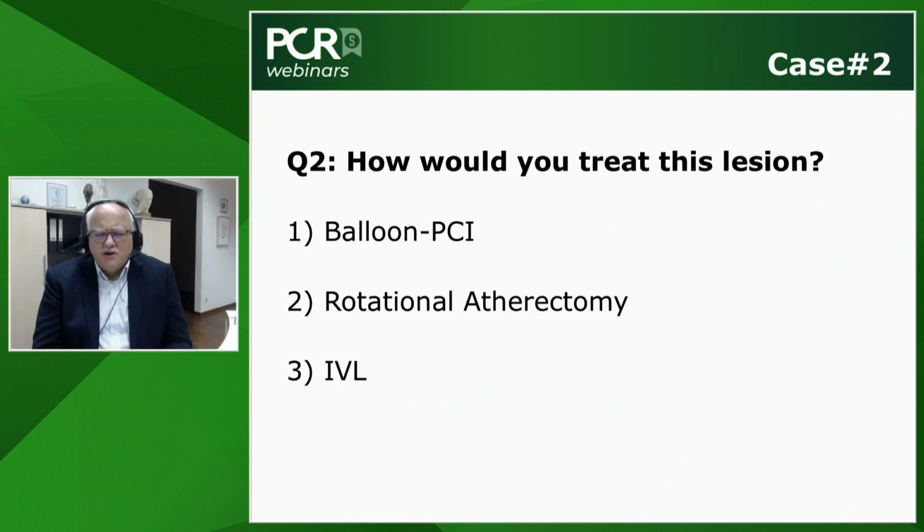So, Emanuele, Benjamin, this is a dominant right coronary artery, large vessel, very focal, more distal stenosis, obviously very calcified. The challenge here is the tortuosity of the proximal segment. So first of all, I would like to have a good guiding catheter support. Again, I would consider using a GuideLiner to support that. I would bring down one of my preferred standard wires, and then I would just give it a try with a non-compliant balloon, 1-to-1 balloon to artery ratio, go to the rated burst pressure of the balloon and see whether the stenosis is opening up, yes or no.